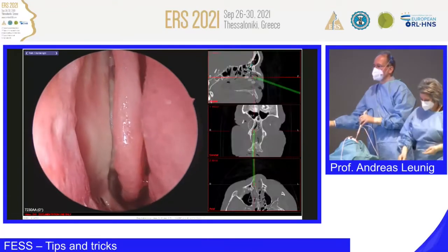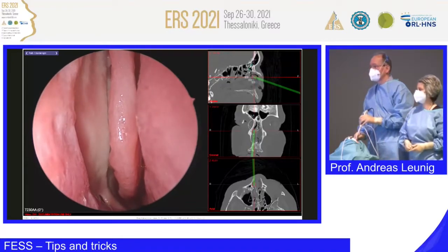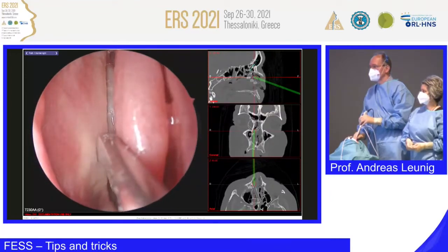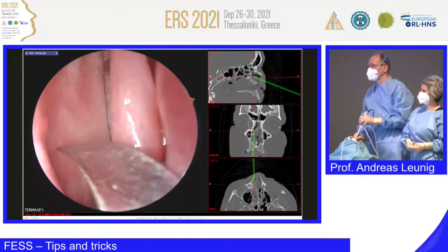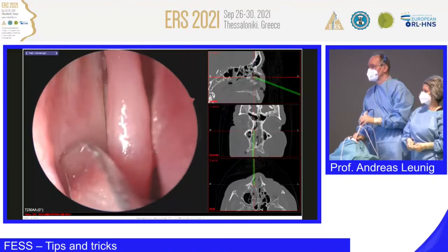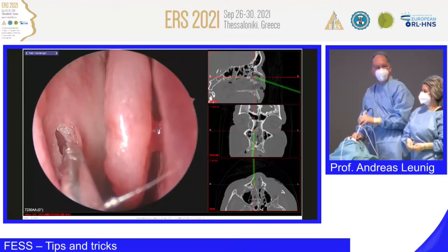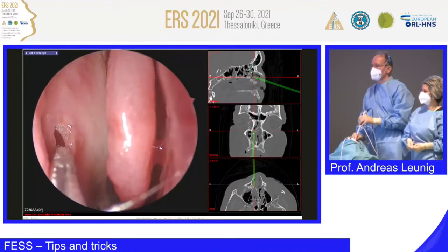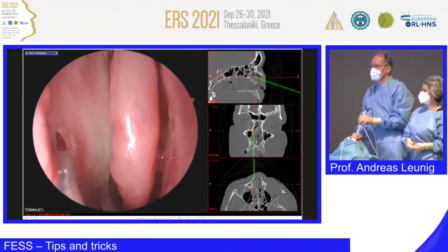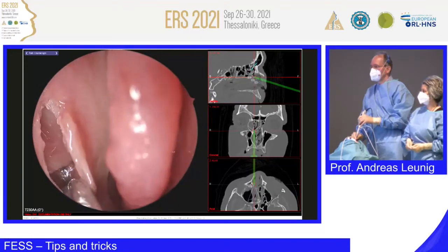So now, very good, very nice, sickle knife, I go in. Now I take my sickle knife, I look again, I look for the flexibility, and I make a small cut here, piercing, and you rotate, you go inferiorly, and during this maneuver I try to pull the uncinate process medially. And what do we see now? There's some black hole. What's the black hole?